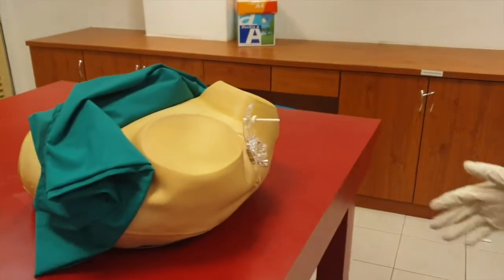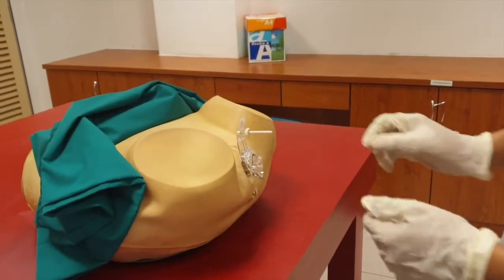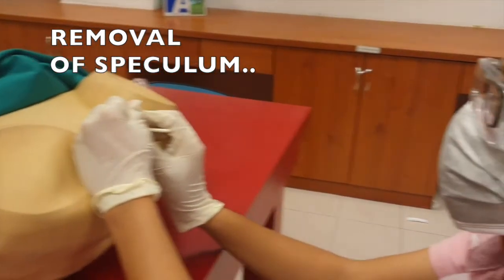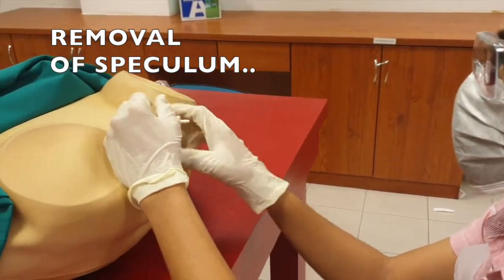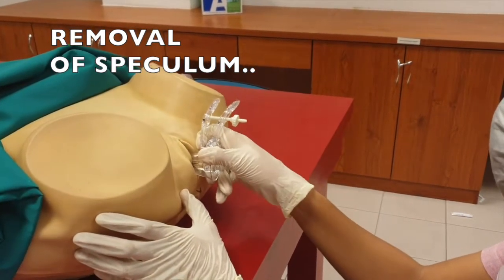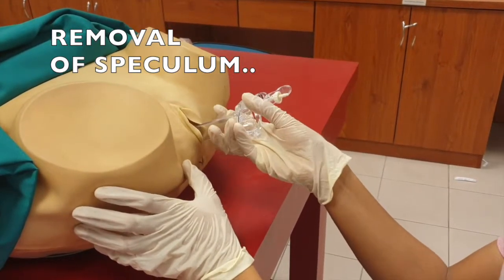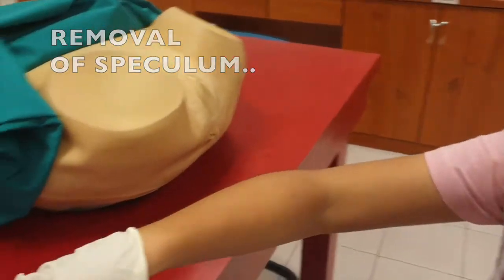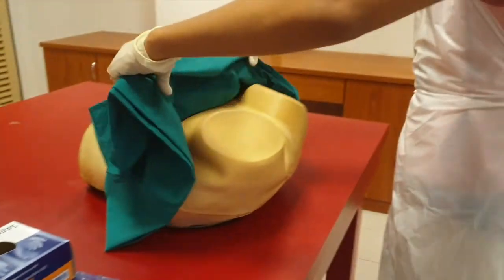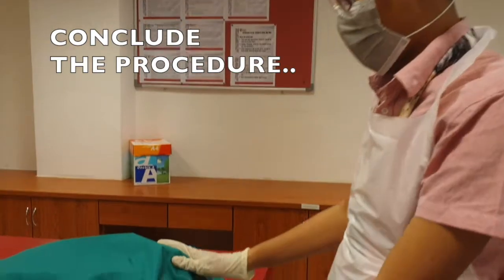Now you're done with it, you want to remove the speculum. Okay puan, sekarang saya nak buka speculum tu. Mungkin sekali lagi lah, mungkin ada tak selesa atau sakit, minta maaf puan. You unscrew the speculum, close it, and then carefully you remove it. It's a reversal of the process by which we inserted it before. Once the speculum is out, you cover the patient back, and then you thank the patient. Okay puan, dah selesai untuk prosedur ni.